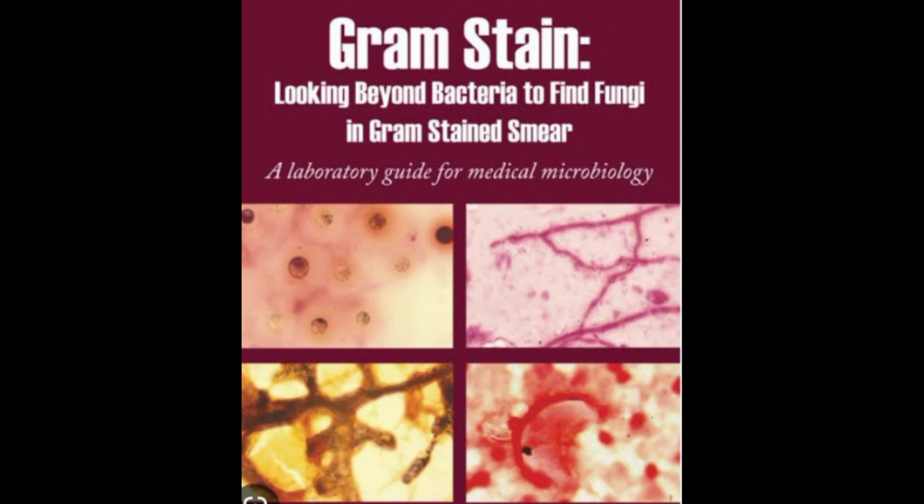Urine: instruct the patient to collect a clean catch midstream urine specimen in a sterile wide mouth plastic container. Sputum: instruct the patient to collect a deeply coughed expectorated sputum in a sterile wide mouth container after rinsing the mouth with water. Throat swab: collect the specimen with a sterile cotton swab, swabbing the tonsillar fossa and oropharynx. Use a sterile tongue depressor if necessary.